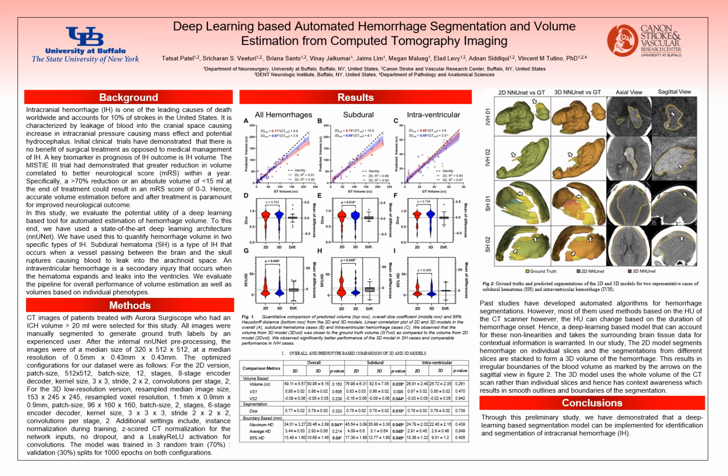For example, currently they use an ABC by 2 method where they look at the volume on a CT image and try to approximate the maximum dimension of the hemorrhage in all three directions and divide it by 2, which is called ABC by 2, where A stands for the length, B is the breadth, and C for the height. So it's three different dimensions and it gives a rough estimate of the 3D volume.